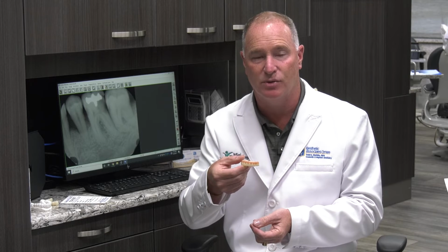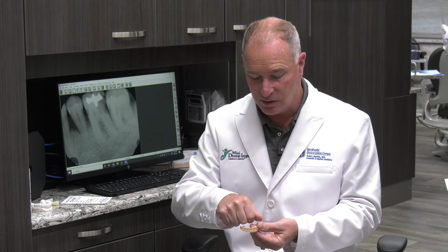and what I usually do is put housings in the patient's mouth on the implants and pick these housings up with a Luxatemp type material or ProTemp or Visalys, whatever product you're using for your temporaries. I squirt it in the trough, pick up those housings at the time of implant placement, and the patient has a nice looking temporary to wear for the next several weeks while we're going through these steps to fabricate the final restoration. That's pretty much it.